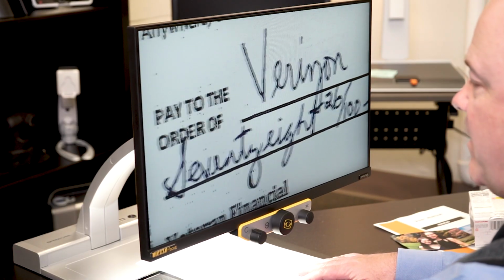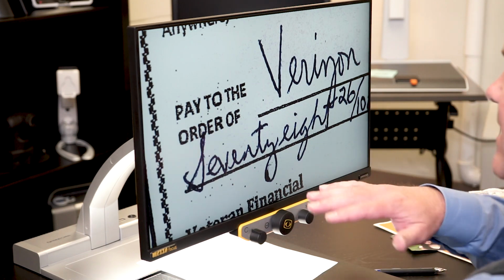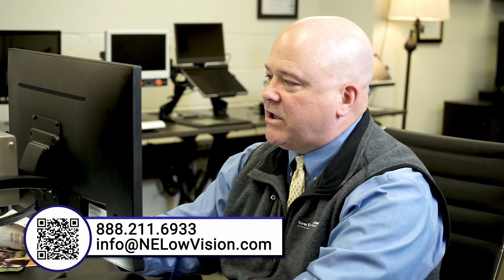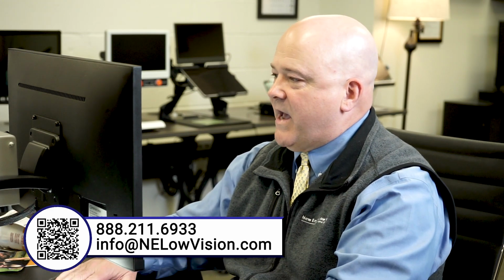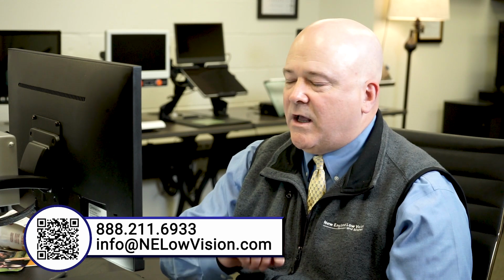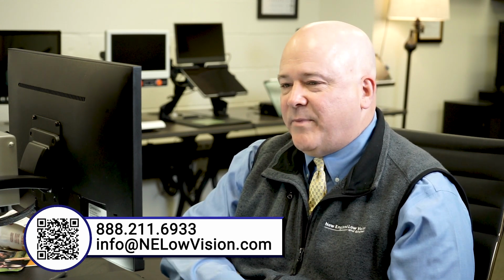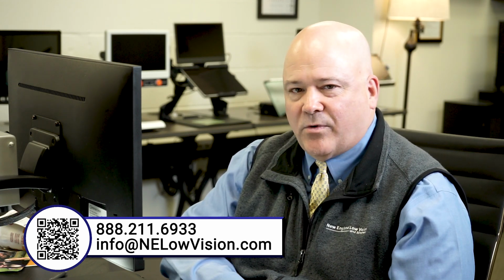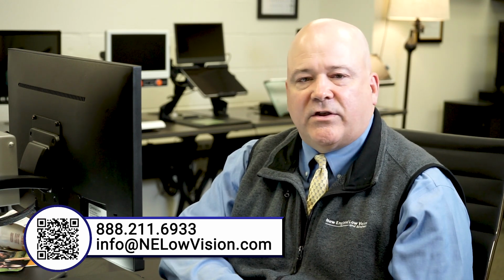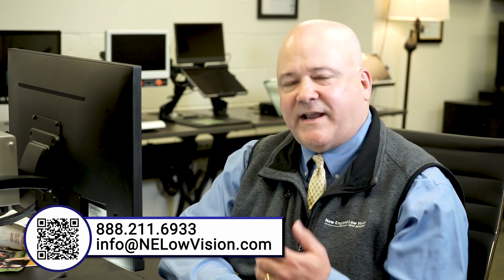This is what most people have a hard time doing. They can't write checks. They write diagonally because they can't see it. Now, because it's enlarged, you can see it and you can make out your check. And this is how people are managing their finances. They're writing out envelopes. And one of the big things to use the Mezzo for, in addition to all of the reading and looking at photographs, is writing tasks like writing out checks.